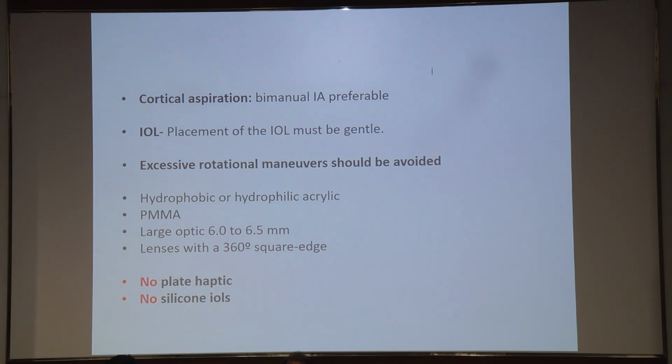IOL placement should be very gentle, and the choice of IOL should be hydrophobic or hydrophilic, or you can use the PMMA also, but silicone IOL should not be used. Large optic IOL should be used with 360-degree square edges, and plate haptics and silicone IOLs must not be used.